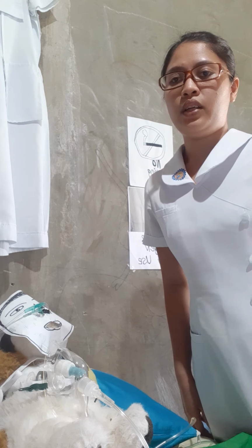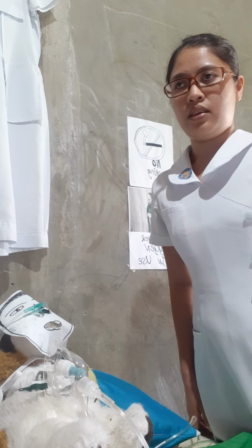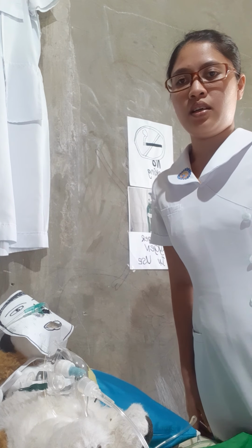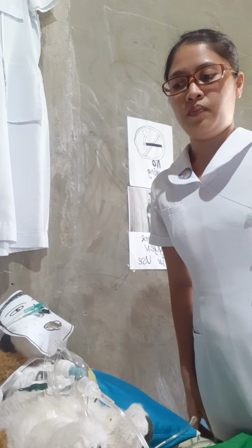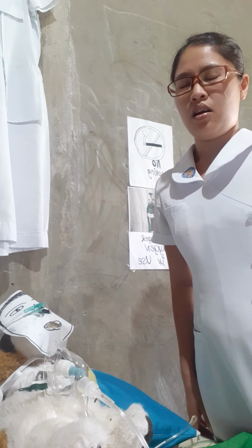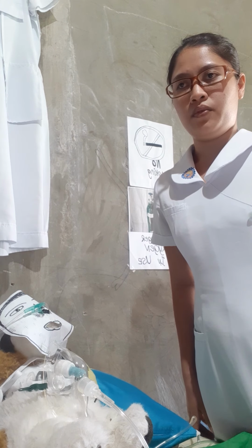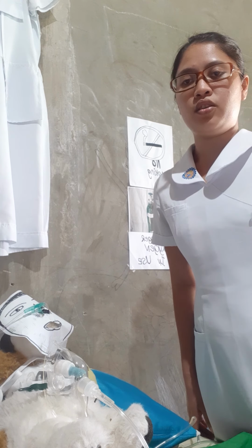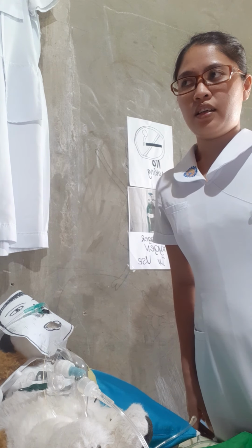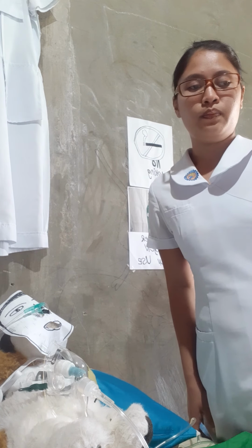As for assessment, we need to assess the client's respiratory status, including ease of breathing, rate, rhythm, depth, lung sounds, and oxygen saturation level. Also, pulse rate, character and amount of secretions from tracheostomy site, the presence of drainage on tracheostomy dressing or tie. And next, appearance of incision. We need to note for any redness, swelling, purulent discharge or odor.